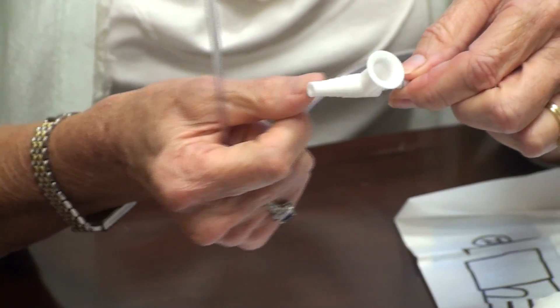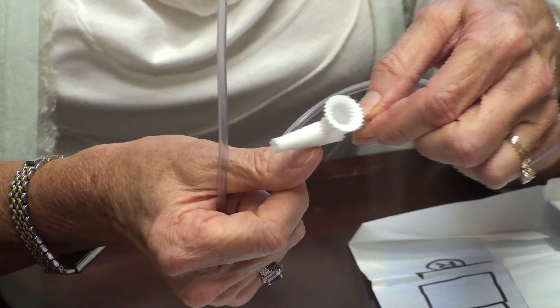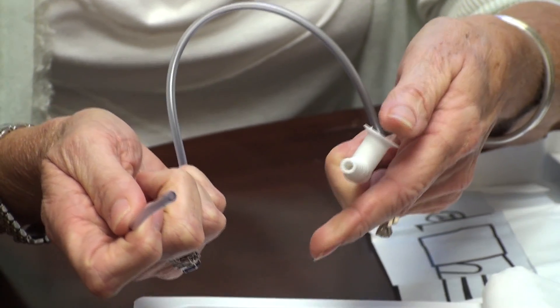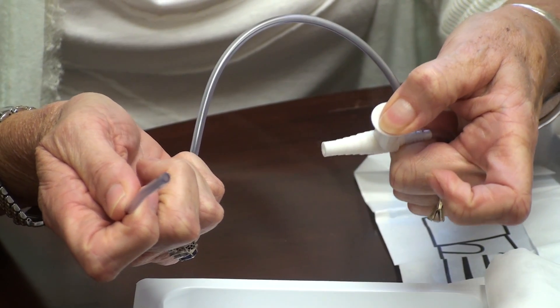All right, the end of the catheter down here will remain sterile. This part up here, the connector, fits into the suction catheter from the wall mount. And when you actually apply suction, you're going to put your thumb over the chimney spout there.